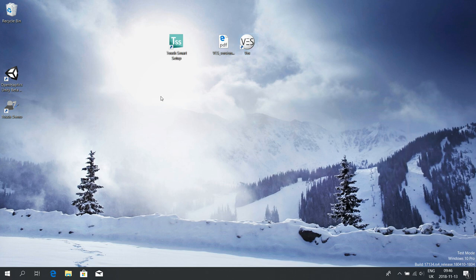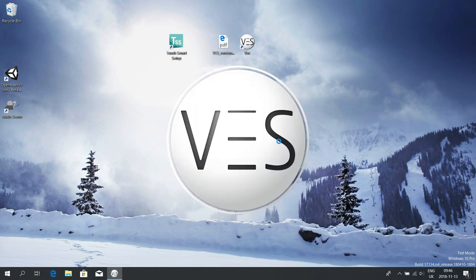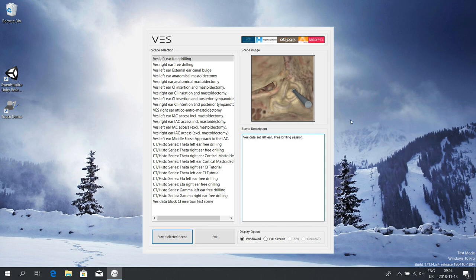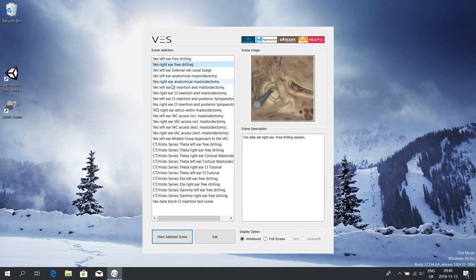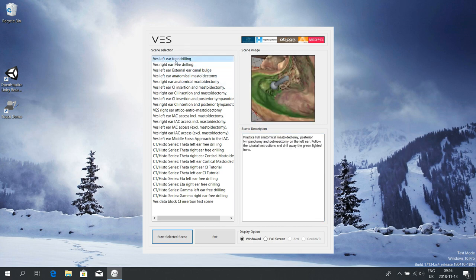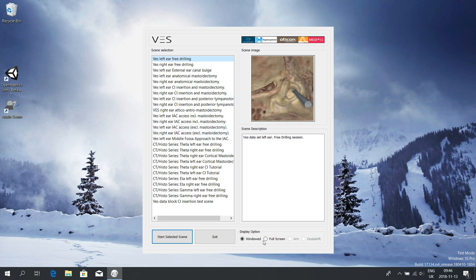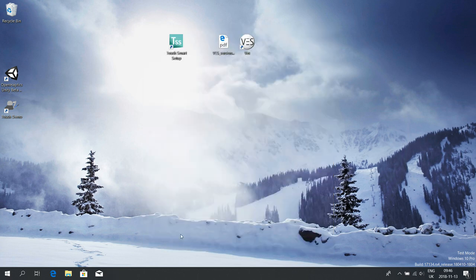When you're done with that, you can start the Visible Air simulator simply by clicking on the icon. You can choose any of the ongoing exercises. If you want to make sure you have full screen set, then start the selected scene.